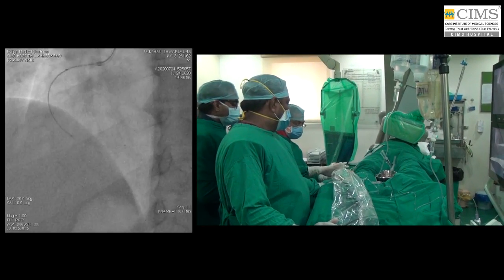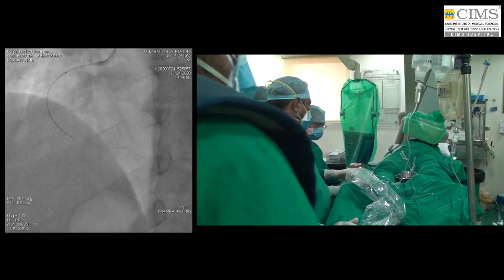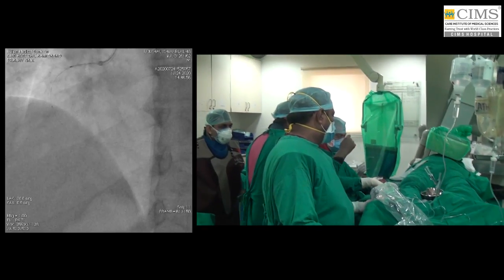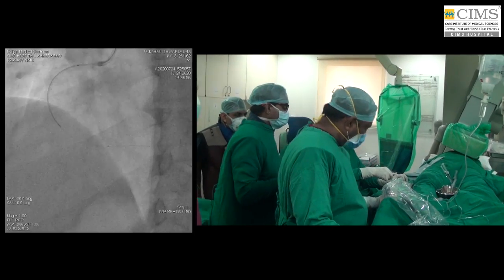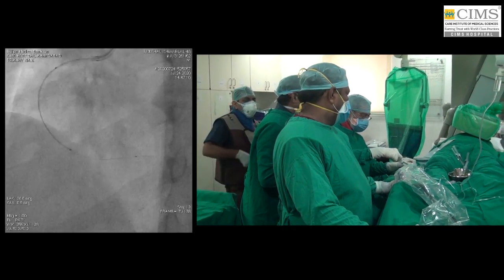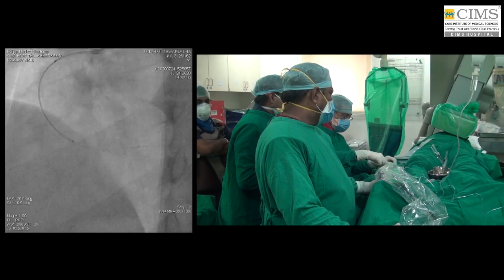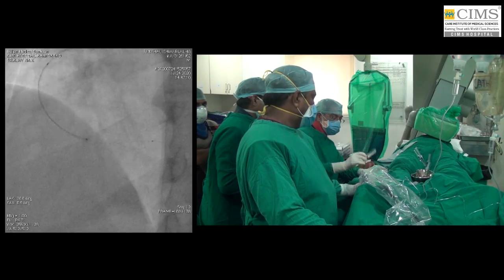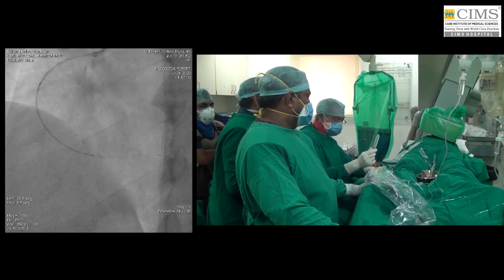We use IVUS in left main, mainly ostial left main, where the dye issue is there with OCT. But there also we have found with good placement, OCT works well. And second is when the patient is nephro with renal compromise, then we use IVUS.